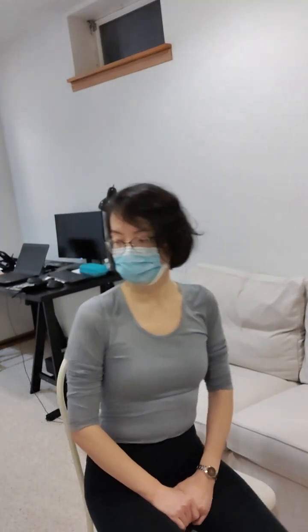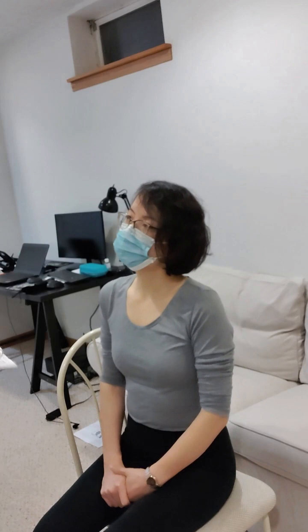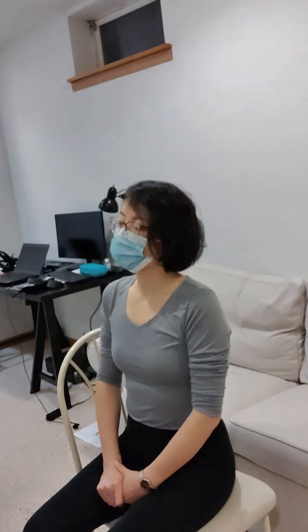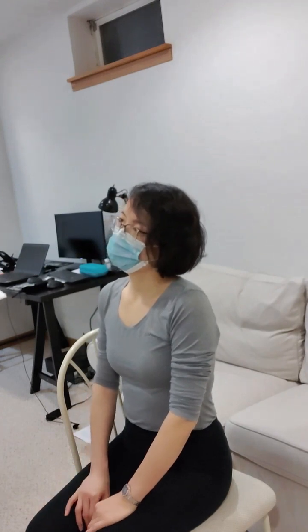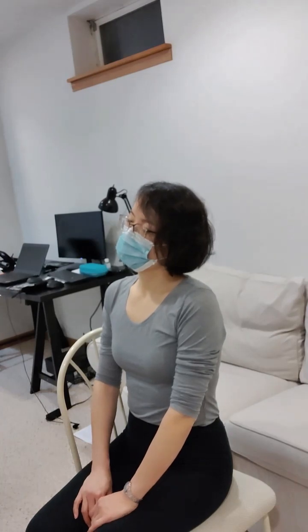So, all right, I can hear normal lung sounds. I can hear some vesicular and bronchial sounds. I don't hear any abnormal lung sounds like crackles, rales, wheezes, rhonchi, stridor, or friction rubs.